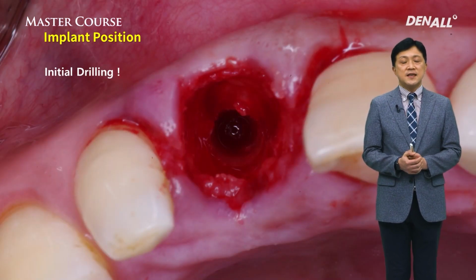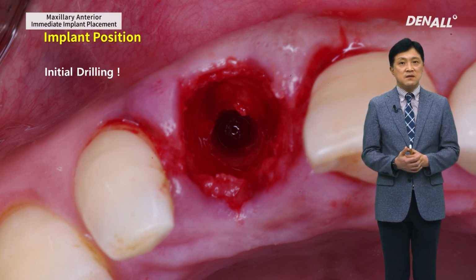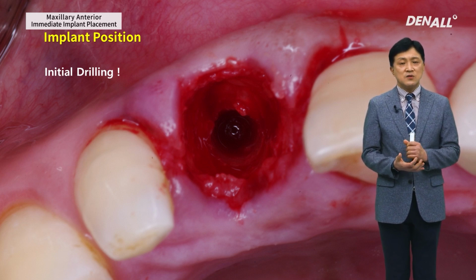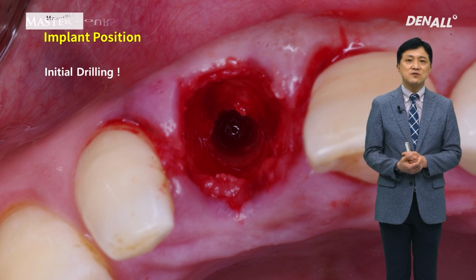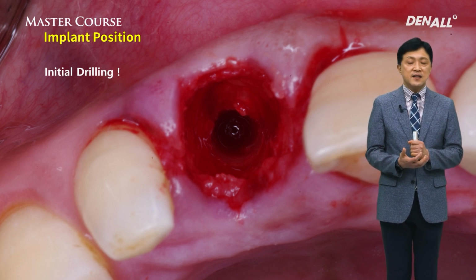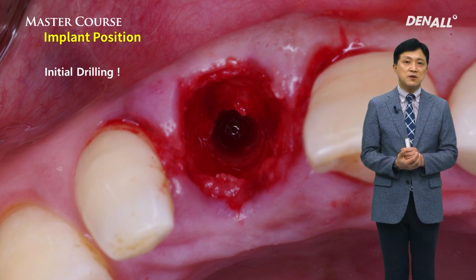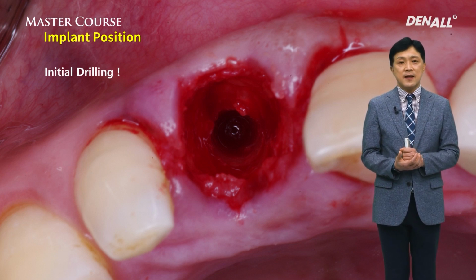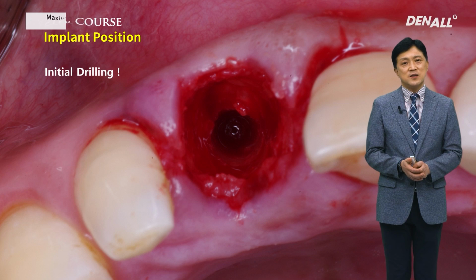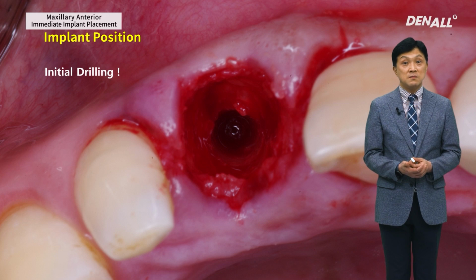Next, let's talk about implant positioning. To determine the implant position, we need to do drilling in the upper anterior. For immediate implant placement, the most important thing is the initial drilling. Initial drilling should be done in the appropriate position, angle, and depth. If we drill in a wrong position, it is very hard to modify the position. It's almost impossible. So the initial drilling is very important.